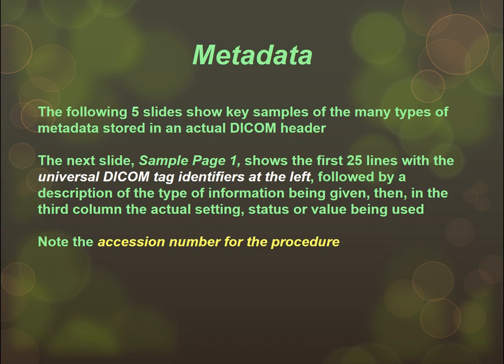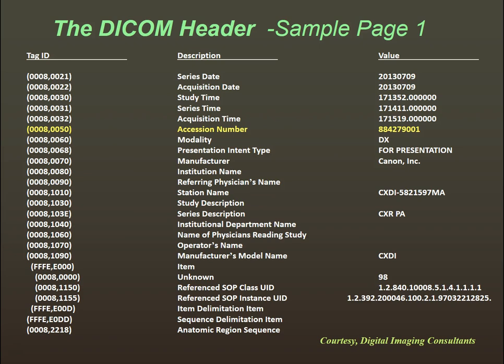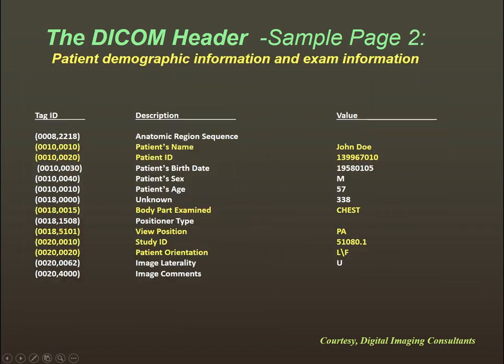And the accession number is the most important number in imaging. It is the one number to rule them all. So here you can see the DICOM tags, right? DICOM tag 0850. We typically don't read the leading zeros. If I was talking to another PACS admin, I'd say check 0850. And you can see that's the accession number, and there's the accession number for that particular study.